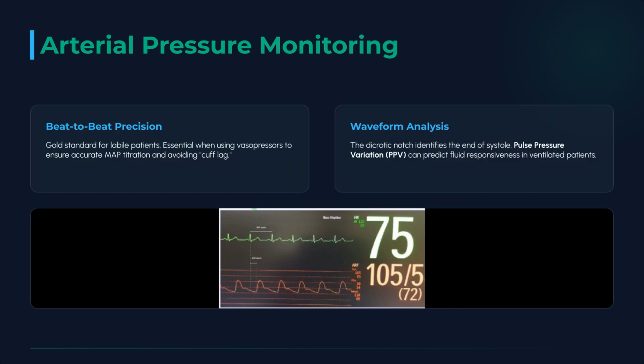Arterial pressure monitoring offers beat-to-beat precision, which is the gold standard for labile patients and essential when titrating vasopressors. Waveform analysis, including the dicrotic notch and pulse pressure variation, provides further clinical insights.